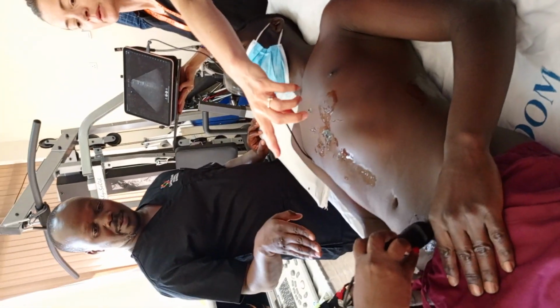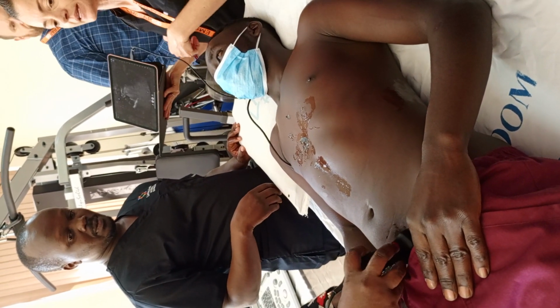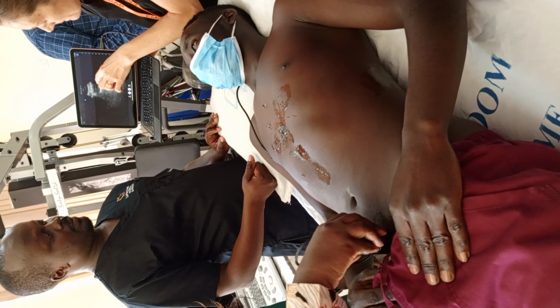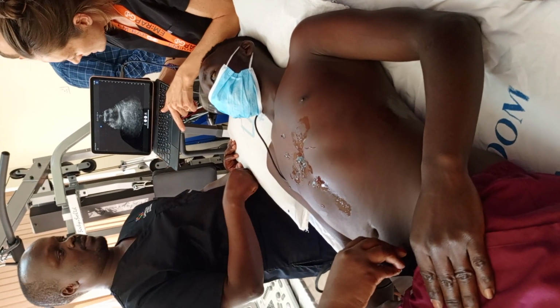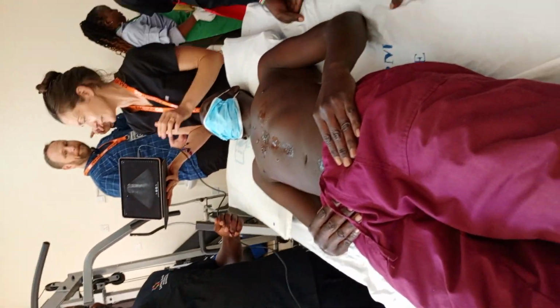Ooh, okay, so now remember, you can do it either way. I prefer to just have the indicator towards him, towards his right. Yep. And then remember, where's our bladder? It's a little low down, so you're gonna fan down. Exactly. Good. Feel good? Okay. All right. Switch. You good? Are we hurting you? Okay.